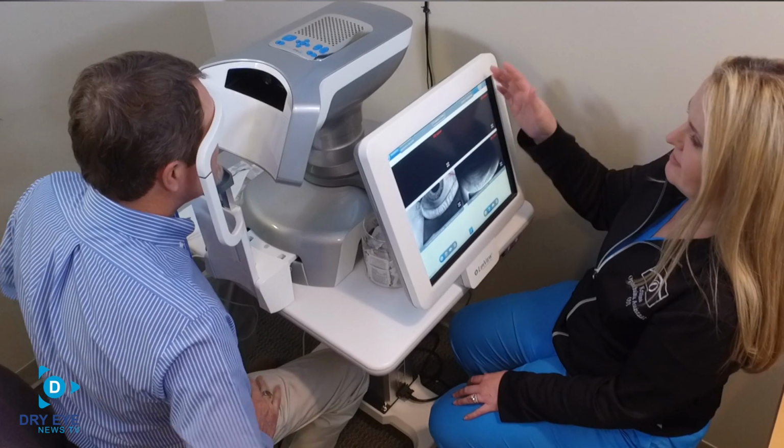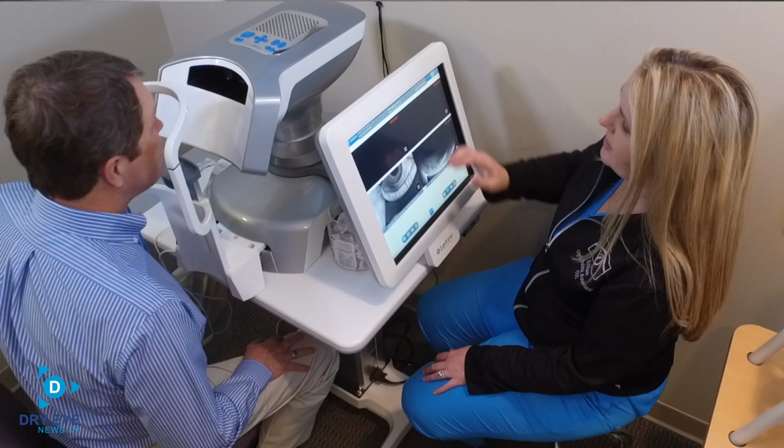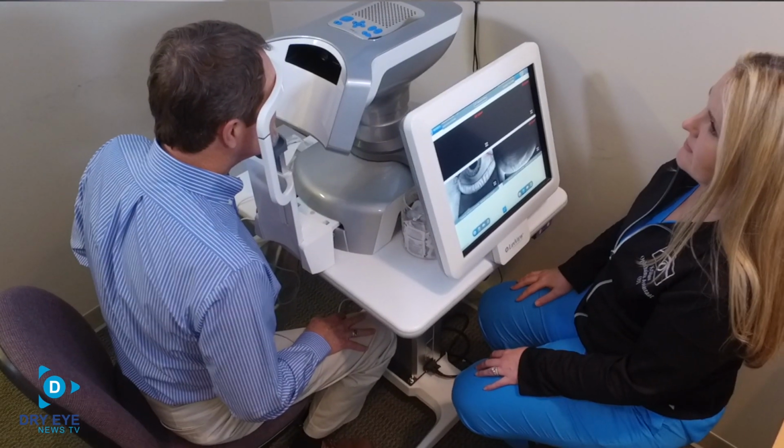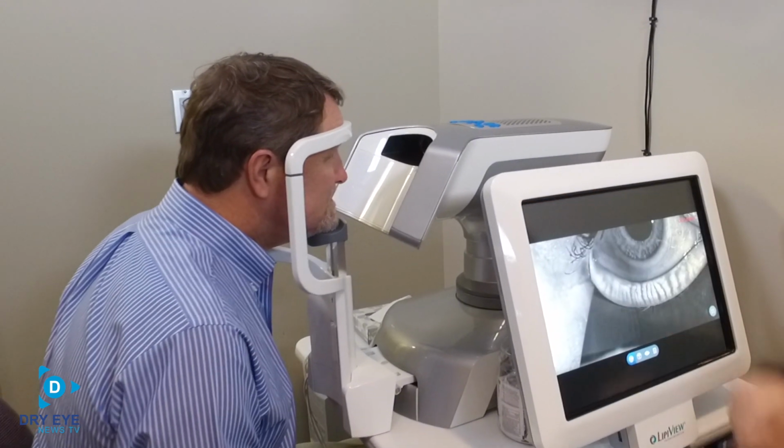We're here today to talk about how we are using the Lipiview and Lipiflow systems in our practice for patients with Meibomian gland disease. The Lipiview is where we start. It's a key tool to help us educate our patients, especially patients who are asymptomatic with their dry eye disease. The black and white images are easy to capture. Our technicians are tasked to take these images, and then they start the education process. While they're showing the patients the images, they are also being educated concurrently.